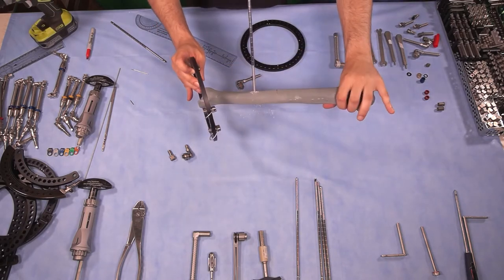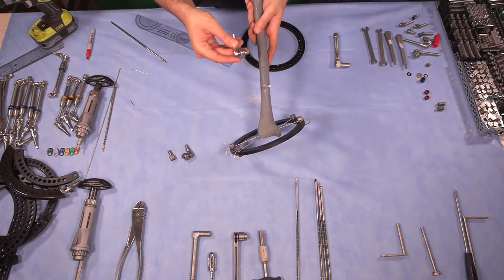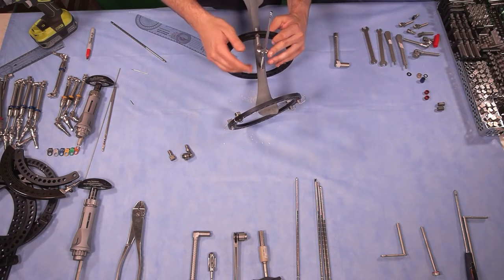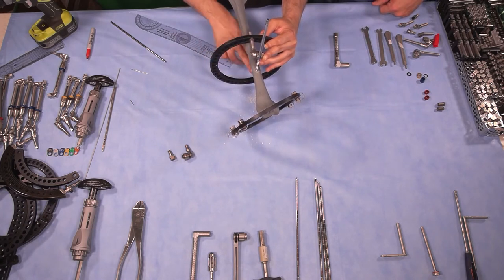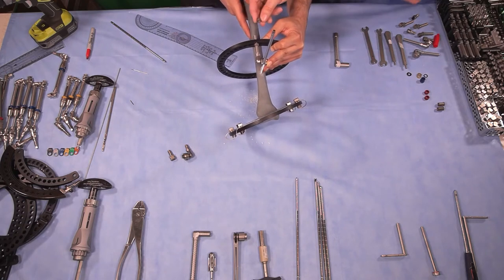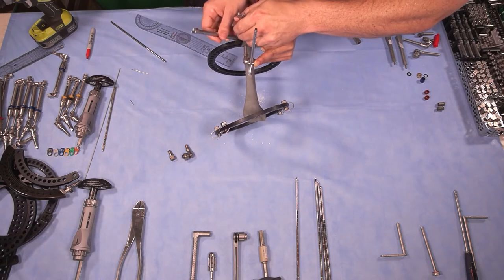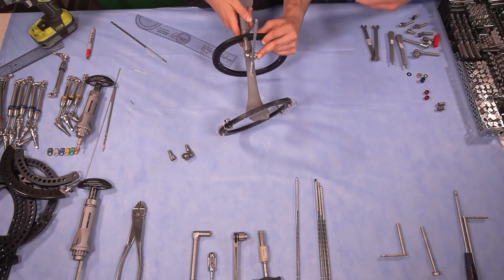Now that the pin is orthogonal to the diaphysis and directly anterior to posterior, we place the ring and attach it directly in the center. You have to be mindful of soft tissue clearance — the calf is typically posterolateral, so make sure there is enough clearance in that area. We position a nut, tighten the clamp to the ring, then tighten the clamp to the pin, starting by hand.